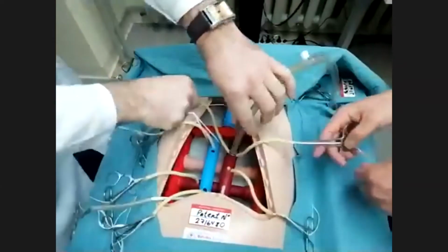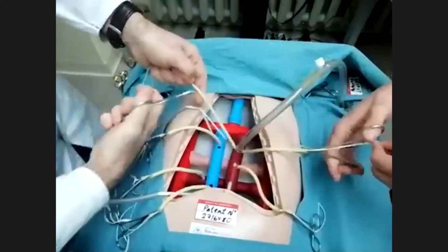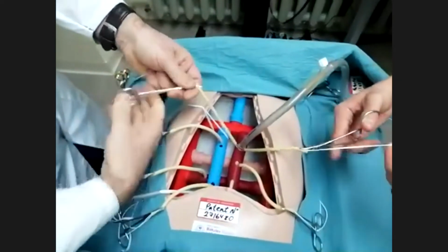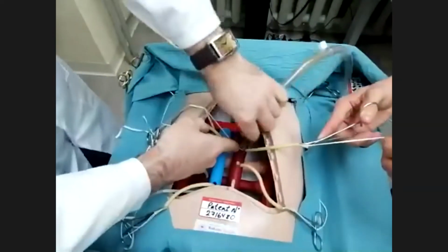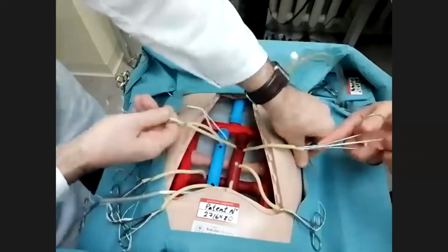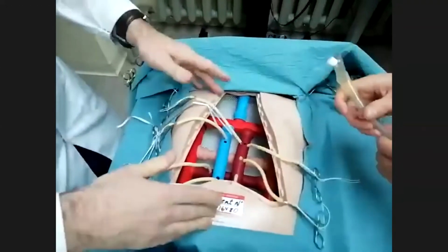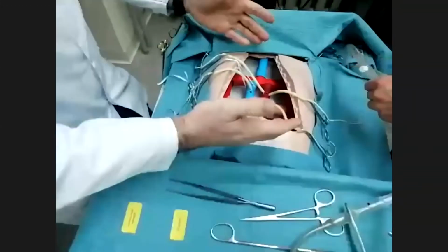It's a very important procedure. I have to control the arterial blood pressure on the monitor. Okay, it's optimal pressure, and then decannulating. Okay, then the protocol is done.